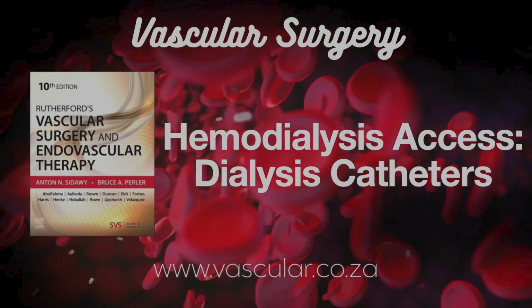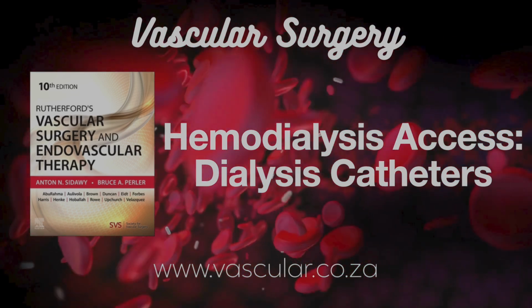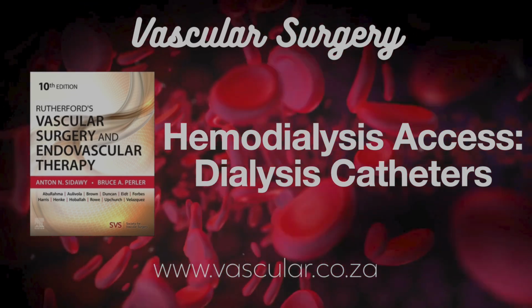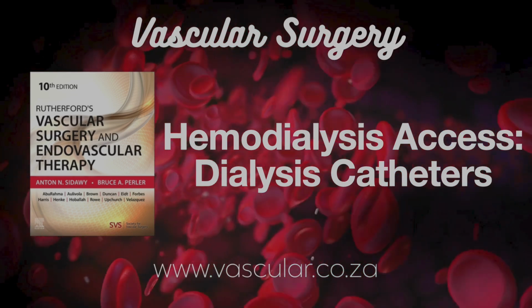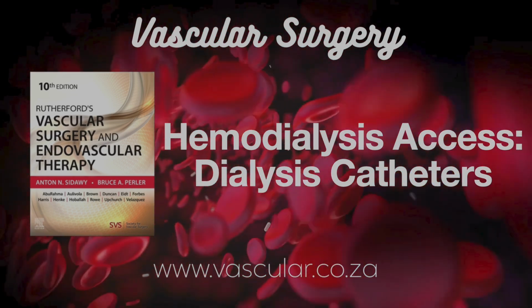Can you prevent these clots? Routine blood thinners like low-dose warfarin haven't really panned out. Higher doses work better, but increase bleeding risk too much for routine use. And studies comparing different locking solutions, heparin, citrate, clot busters like alteplase, antibiotics, ethanol, haven't found one that's clearly superior for keeping catheters open long-term.